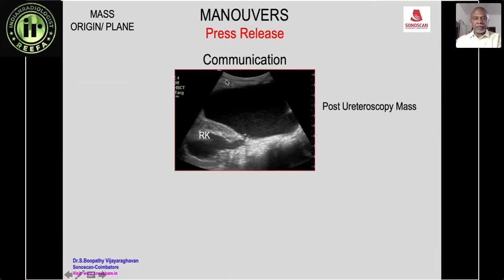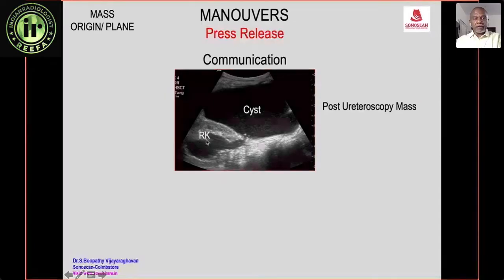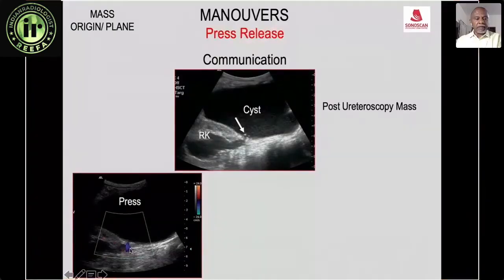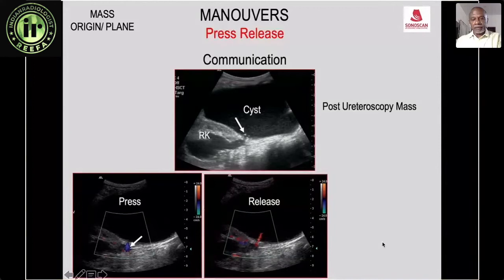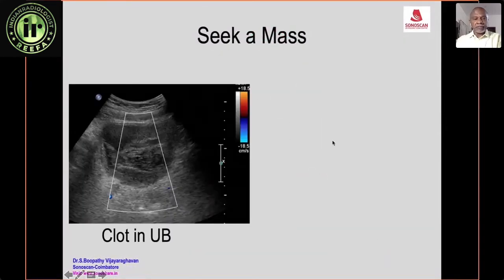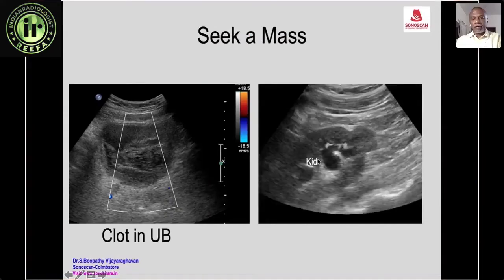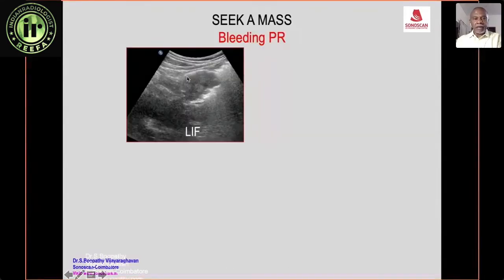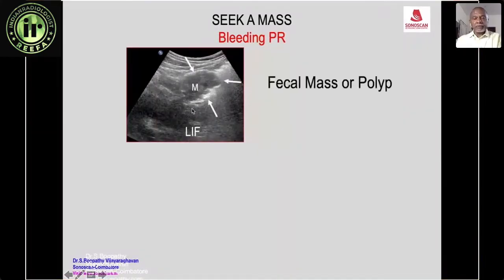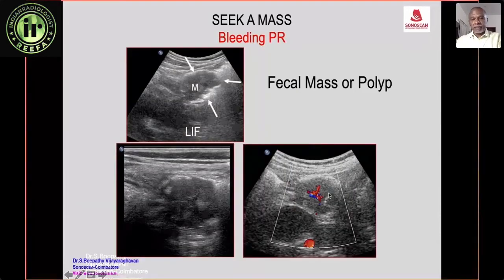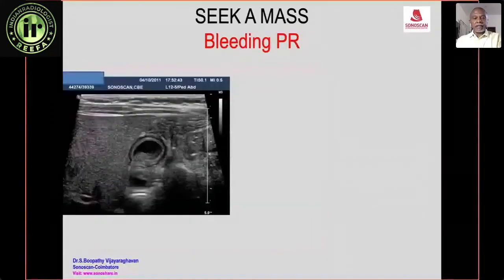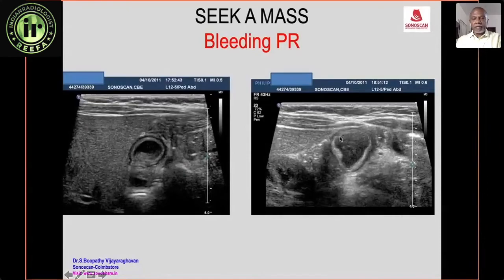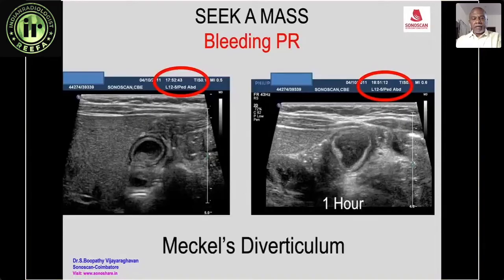Post-ureteroscopy, a large cystic mass with hydronephrosis is seen. Pressing and releasing with color Doppler shows bidirectional flow across a bridge in the ureter — confirming ureteric trauma with urinoma. In a patient with hematuria, a clot and a renal mass are identified on close inspection. For a rectal mass, color Doppler flow inside confirms a polyp rather than fecal matter. A mass with gut signature that remains aperistaltic on repeat scan one hour later is confirmed as a Meckel's diverticulum.